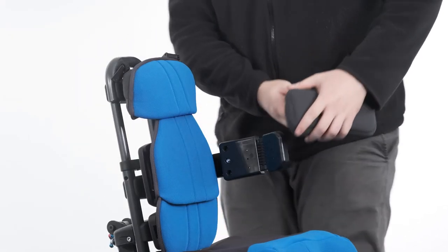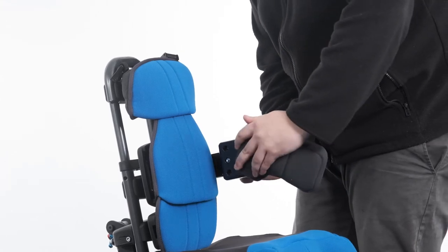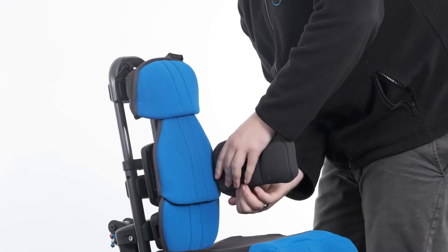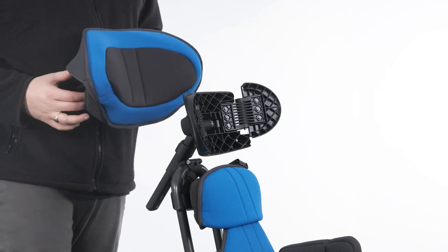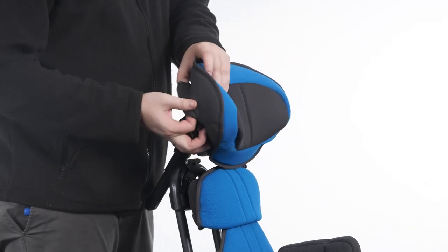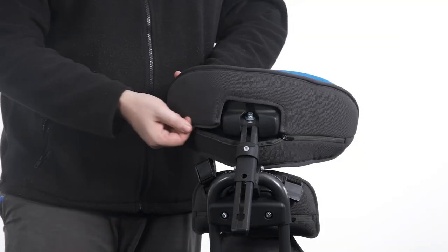Attaching the headrest cover. To attach the headrest cover, align the headrest cover with the front of the moulding and wrap the cover over both ends, securing in place with the zips. Ensure to align the cover so that the zip is closest to the bottom edge.